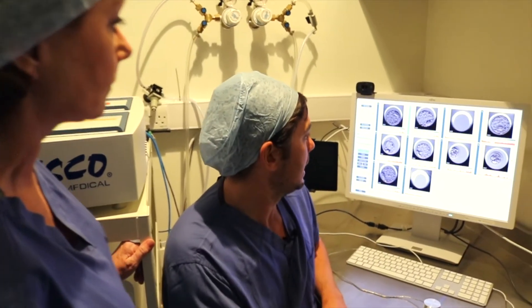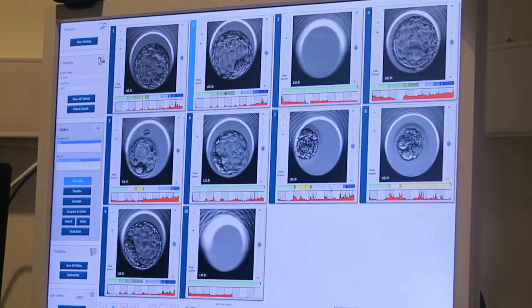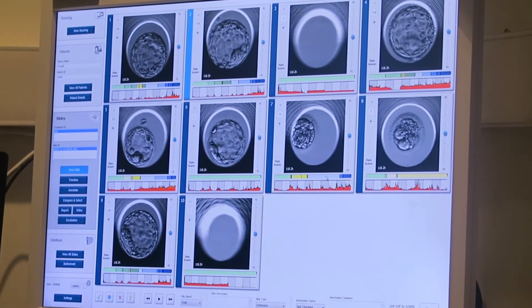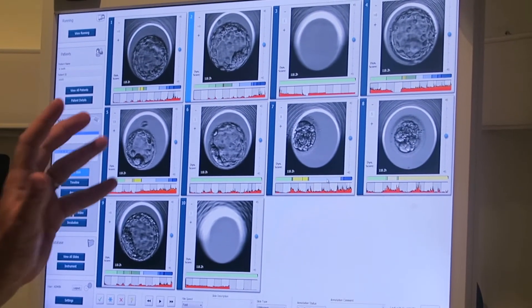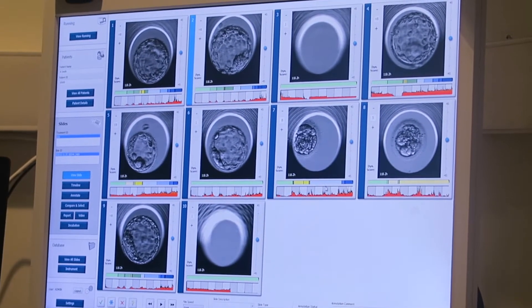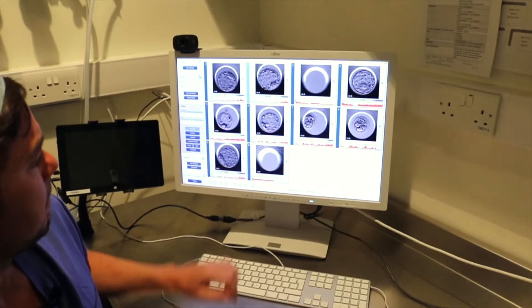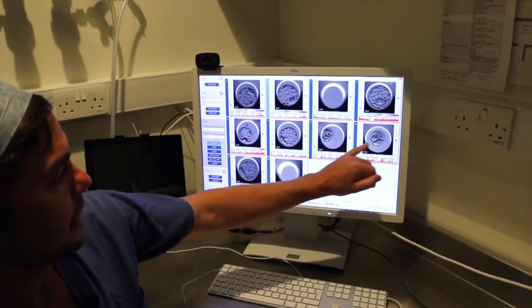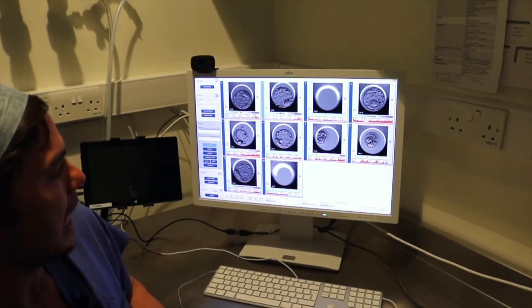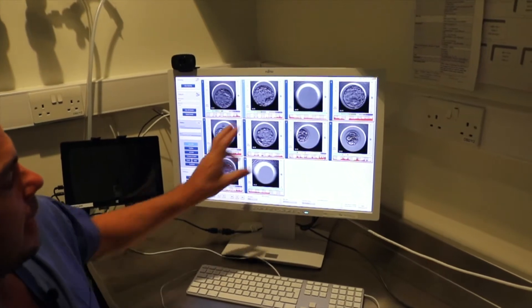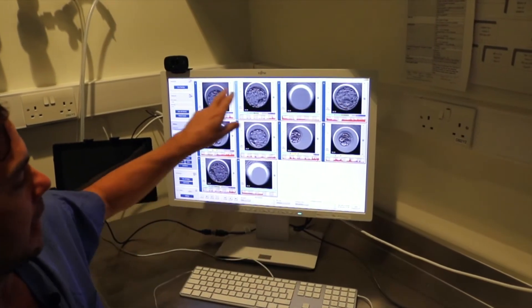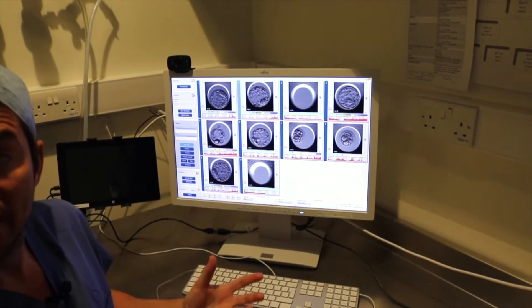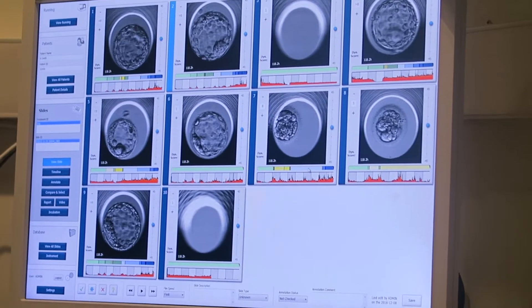If we look over here, these are all of the embryos that one of your patients has. Many of them are at a very good stage, some of them are at a slightly poorer stage — this one, this one and this one — however the rest of them, these other five up here and down here, they're all looking very similar.